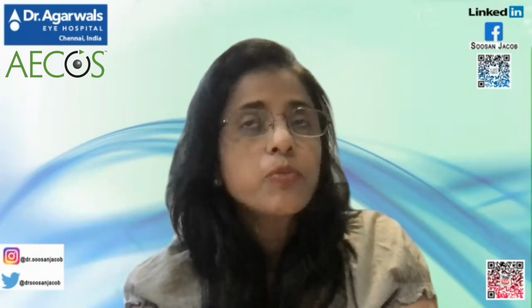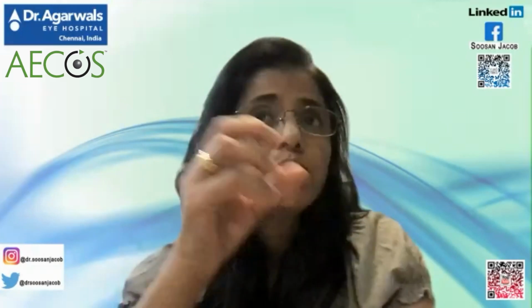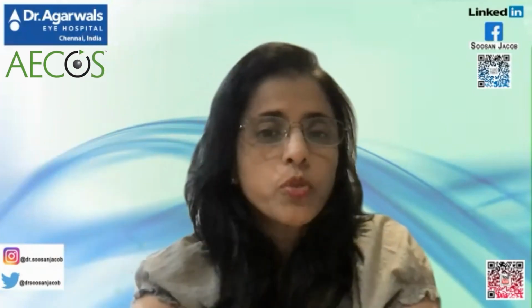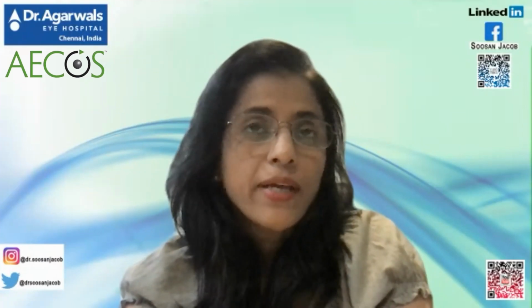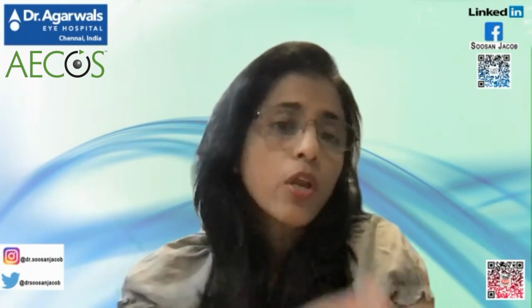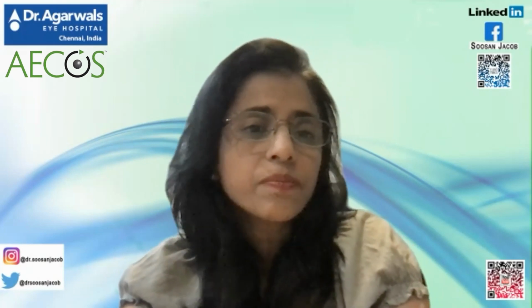And Jack Parker from the US had also started dehydrating it, but not to the extent that Sherry does. He was dehydrating it just so that its volume decreases, and you can push it in, push more tissue in that way. So I don't know whether cross-linking the segment per se would give it any more advantages, but it anyway gets cross-linked, because in most of my cases I combine it with cross-linking. So along with that, the tissue also does get cross-linked.